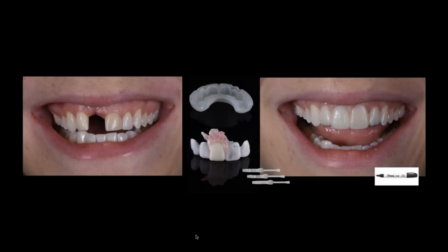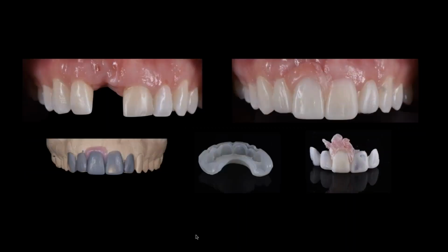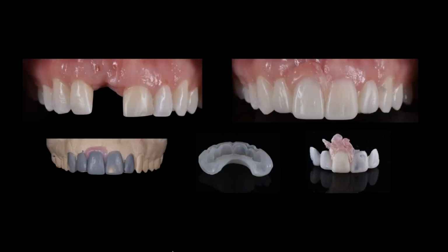That'll get placed in Paige's mouth with our system, and the doctor's going to take a little bit of pink composite to evaluate the position of what tissue we may or may not need as we're working through the case. And he'll black magic marker any areas that stick out past my wax up for the proper length, if we agree with that. I think we actually changed our mind a little bit after we saw it in the patient's mouth. This was kind of a while ago.